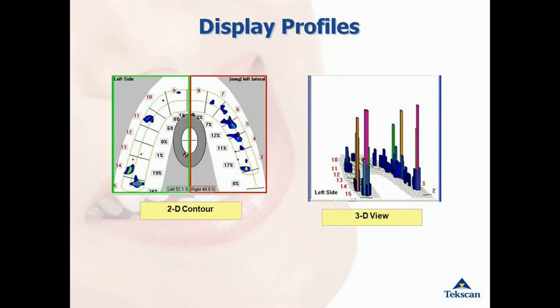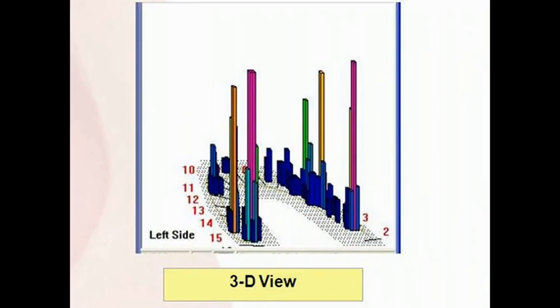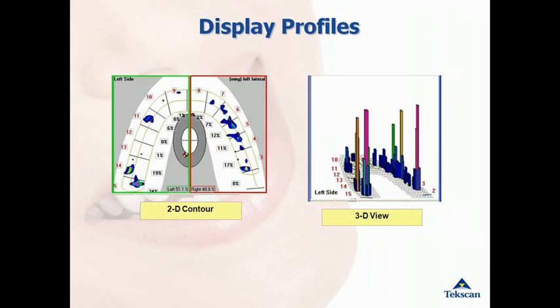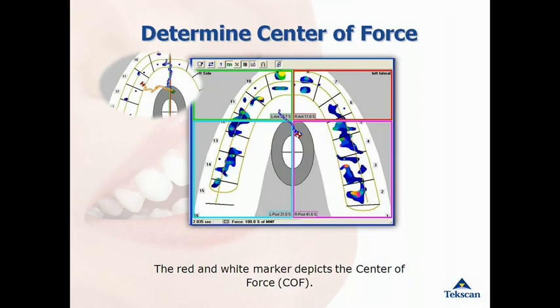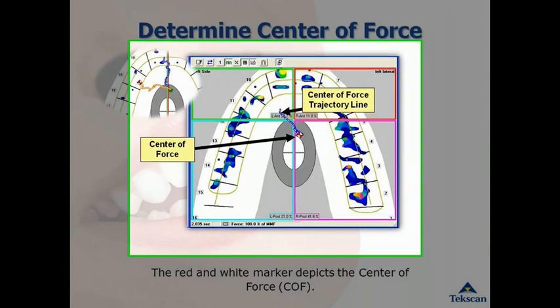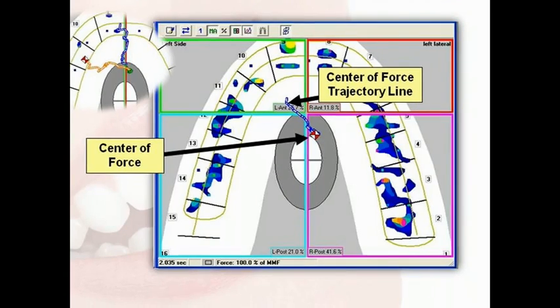T-Scan displays the data in many different ways. There is a 2D contour view that most closely resembles articulating paper marks. There is also a 3D view which is a great tool for patient education because you can see the height of the column correlating with the intensity of the force. Each T-Scan recording has a center of force trajectory line that displays the history of the patient's bite, color coded to easily identify when the patient is occluding, holding down, or where the excursion begins. Each segment of the center of force trajectory line represents one hundredth of a second in time.